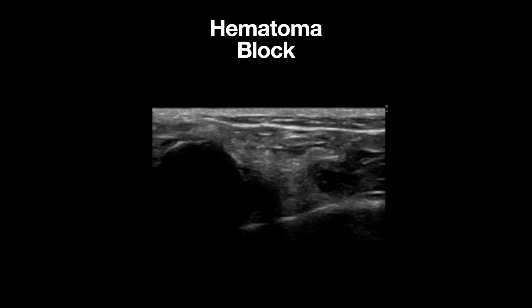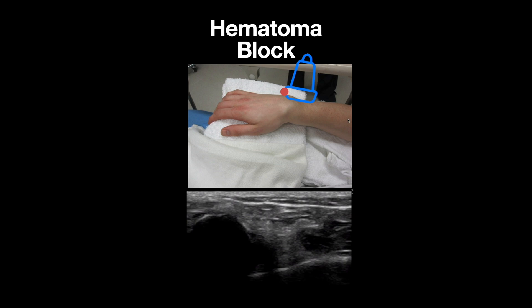This is an ultrasound image demonstrating a dorsally displaced distal radius fracture in a patient presenting to the emergency department after a fall onto outstretched hand. A linear probe is used and placed on the dorsal aspect of the patient's wrist with the probe marker pointed distally.